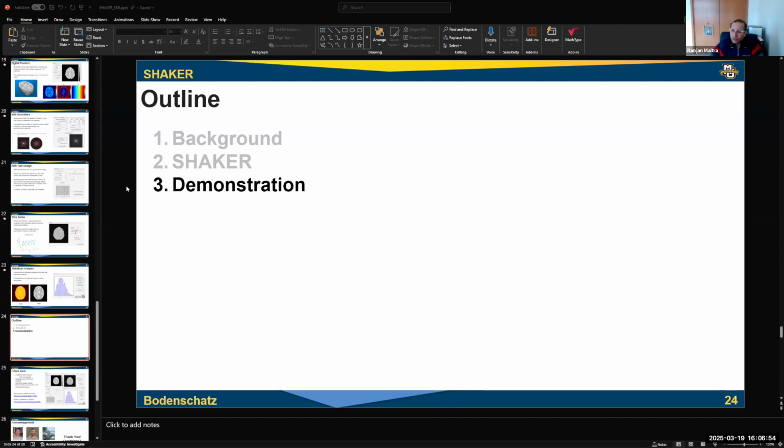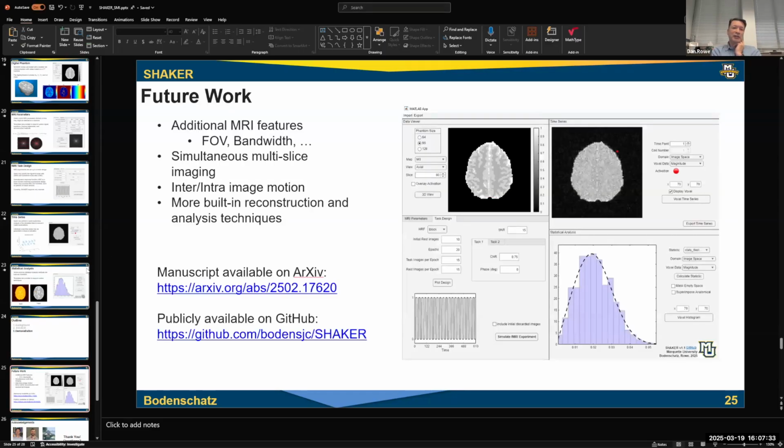Well, so yours is very simple noise, right? Simple in the sense that it is Gaussian noise with independent, basically what leads into Rice noise, right? Yes. Gaussian in the real and imaginary, and then you get that Rician in the magnitude. But do you do any spatial noise, like spatial relationships? Not right now, no. Okay, fine. But John has talked about adding support for processing, so that way you could look at what the effects of the processing were, and hence induce the local correlation from processing.